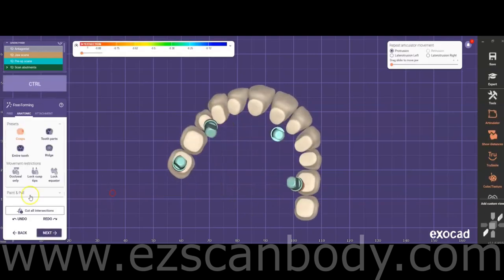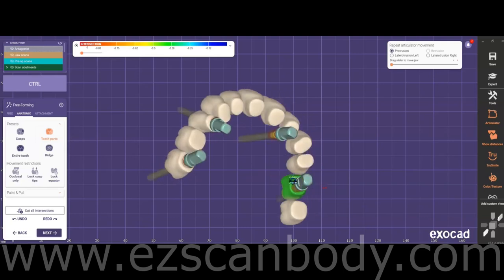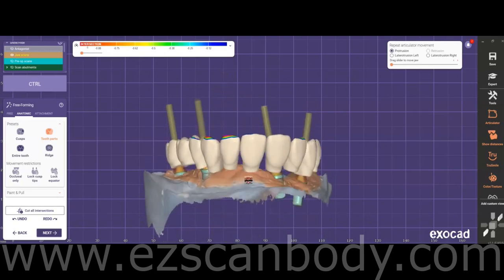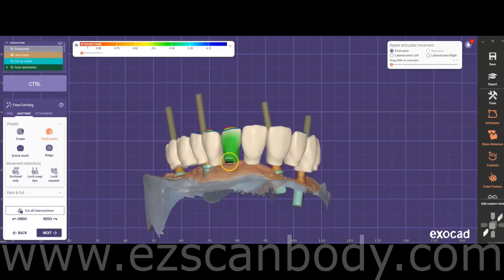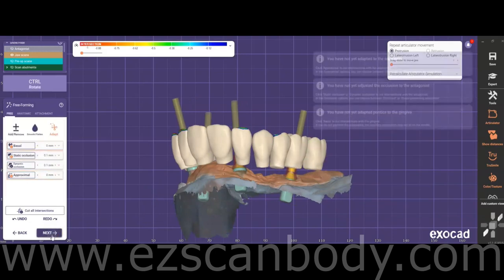Use the freeform tool to refine the teeth and make final adjustments. Check the teeth from the bottom view and move their bases to position them around the analogs if possible. Ensure that all the teeth are aligned harmoniously for a balanced setup.